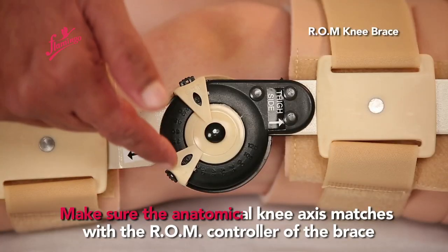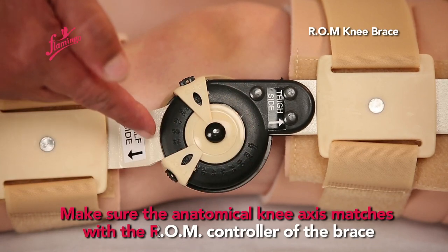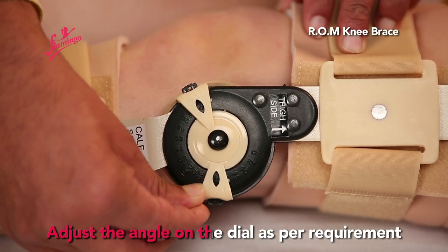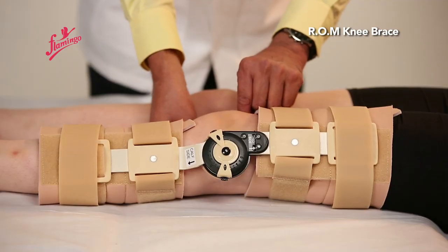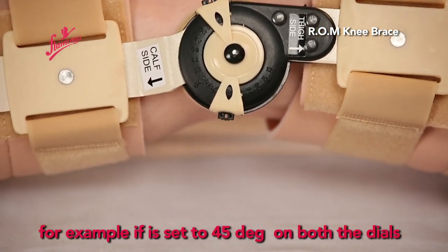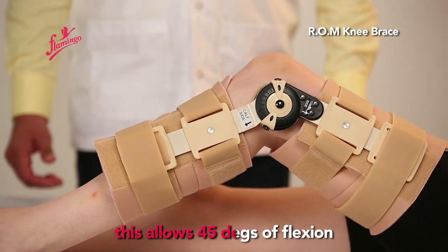Make sure the anatomical knee axis matches with the R-O-M controller of the brace. Adjust the angle on the dial as per requirement. For example, if it is set to 45 degrees on both the dials, this allows 45 degrees of flexion.